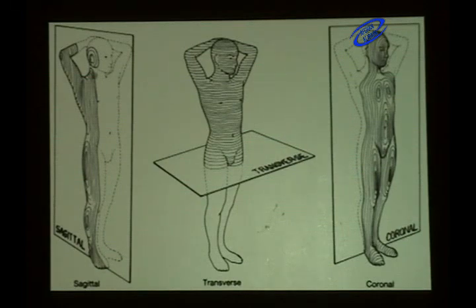In ultrasound, it is very essential to examine each and every structure in at least two planes which are perpendicular to one another, that is either the sagittal with transverse or coronal with transverse planes, to get a better idea of the anatomy and pathology in the structure.